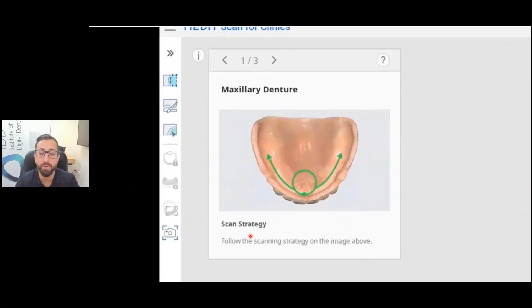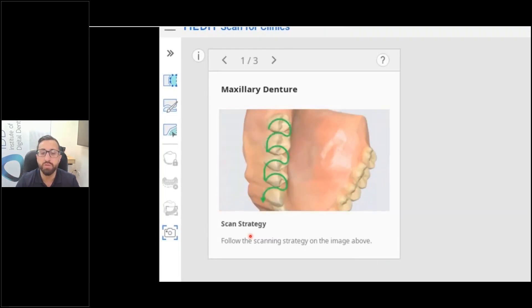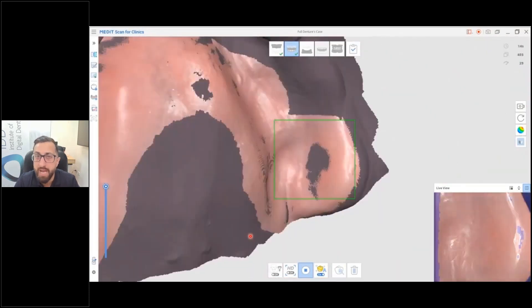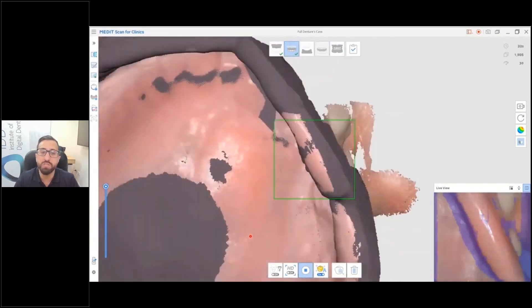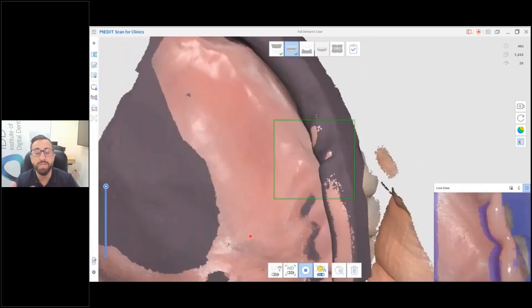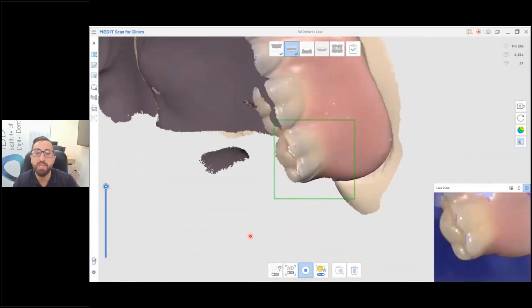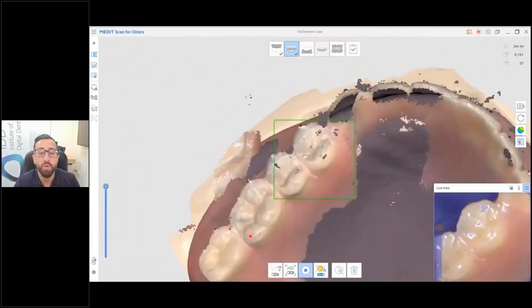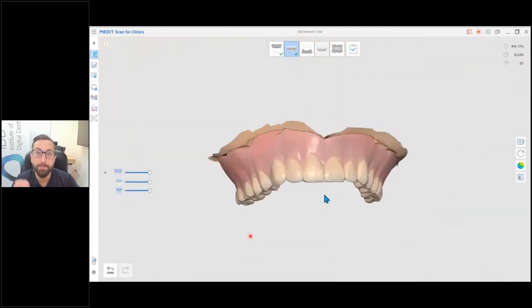Medit software has incredible features for scanning dentures and explains the workflow right in the software. When scanning a denture in Medit, you start with the intaglio surface of the denture because that is the rough surface — you don't want to start on the outside, which is usually highly polished. You scan the entire intaglio outside the mouth, then rotate across and scan the buccal, teeth, and occlusal. Once you scan the intaglio surface, Medit can recognize the fitting surface from your edentulous scan and will join them together automatically.